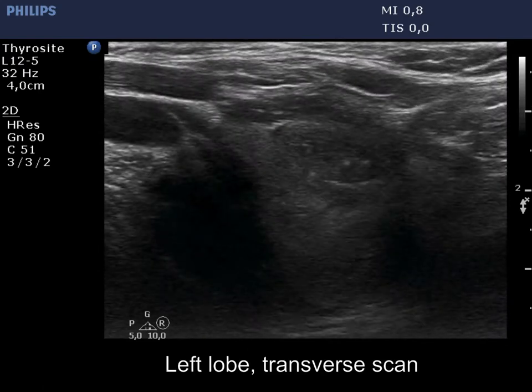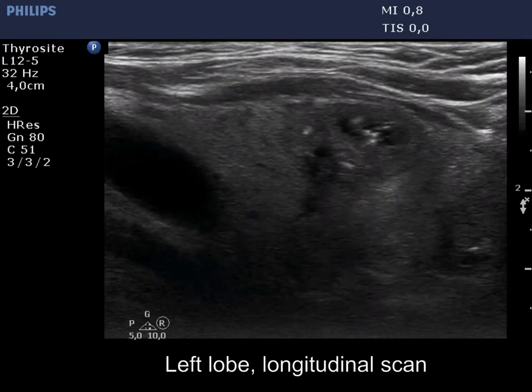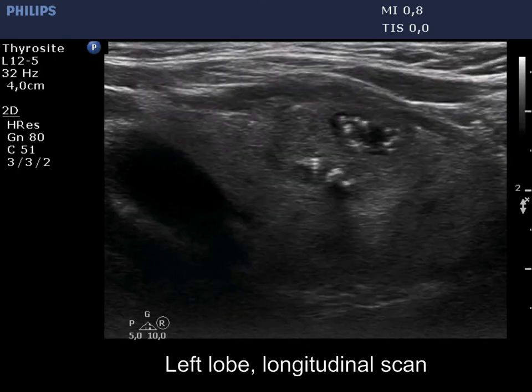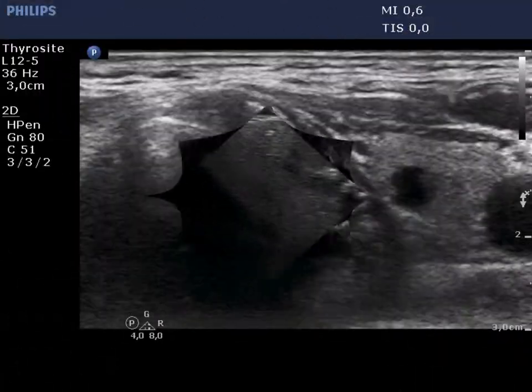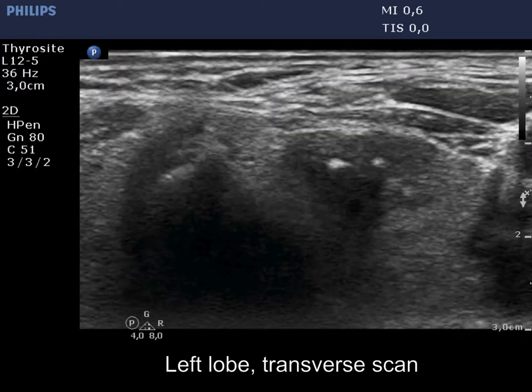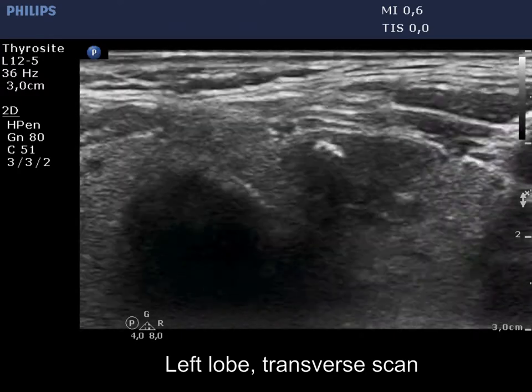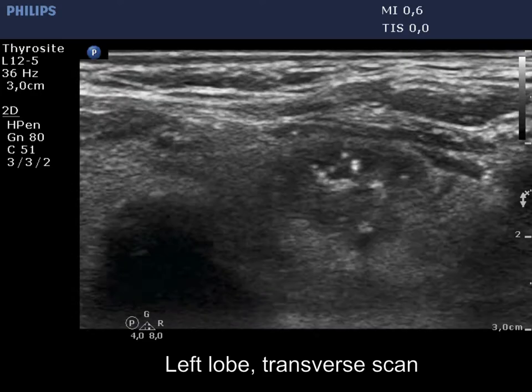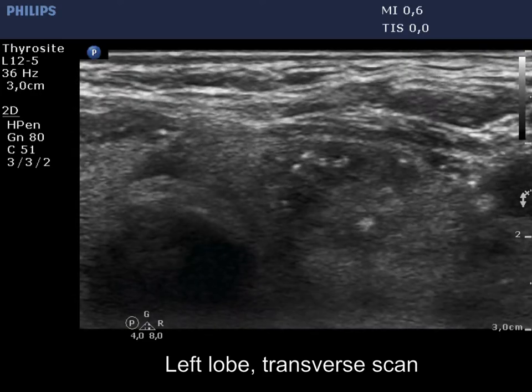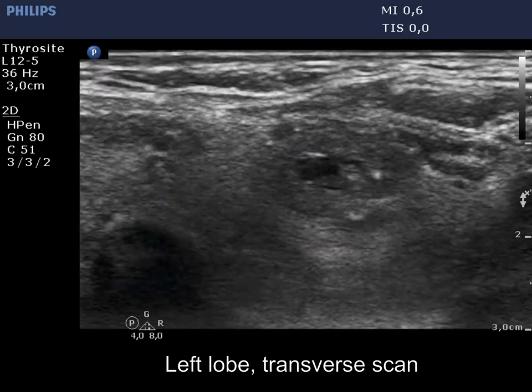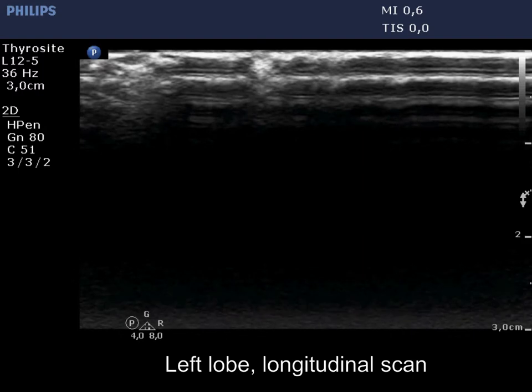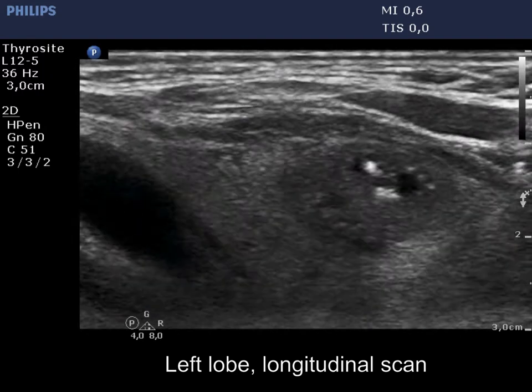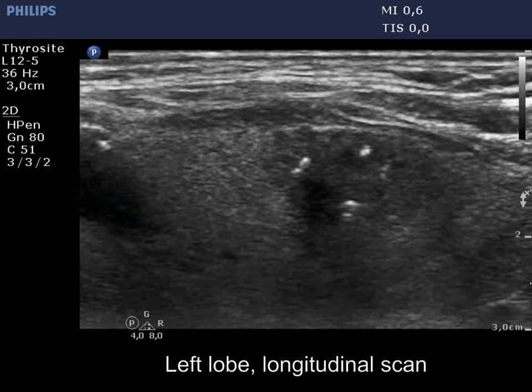We present the nodule by using three different settings. First, we choose the best resolution. Now the nodule is demonstrated by using the best penetrance. The question is the origin of smaller echogenic granules which form clusters. These figures partly correspond to groups of microcalcifications.